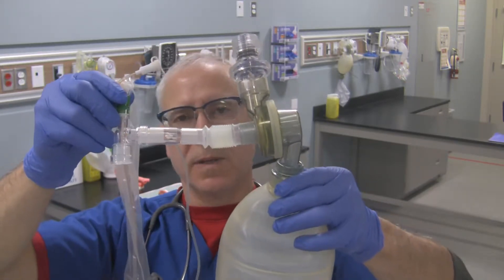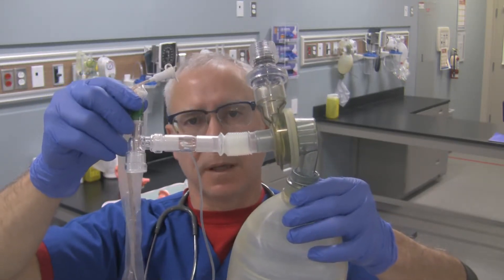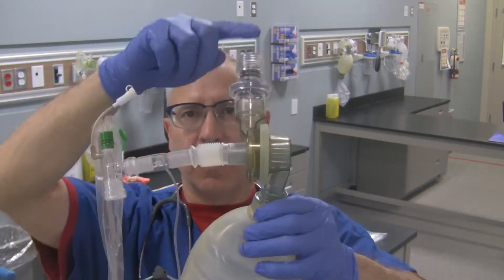Resume ventilation once the stylet is out of the endotracheal tube and the cuff has been inflated. You're probably wondering why we don't use PEEP when doing bag valve mask ventilation. If you're doing BVM ventilation, the PEEP applied to the patient's airway will also be applied to the esophagus and stomach, meaning some gas will be directed there during exhalation. So in our area we don't use PEEP during BVM; switch over and use PEEP once you go to bag valve tube ventilation.